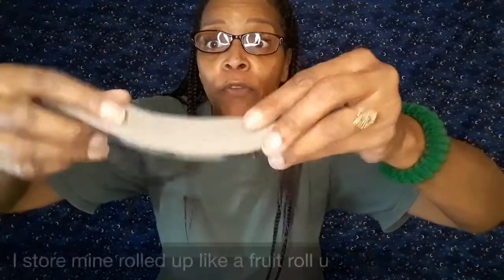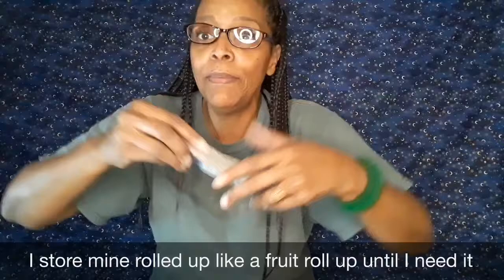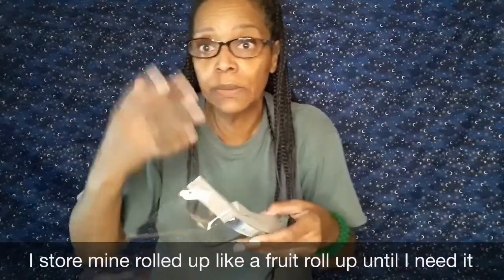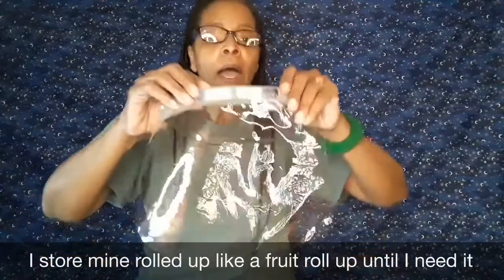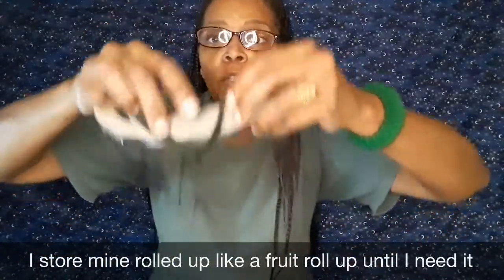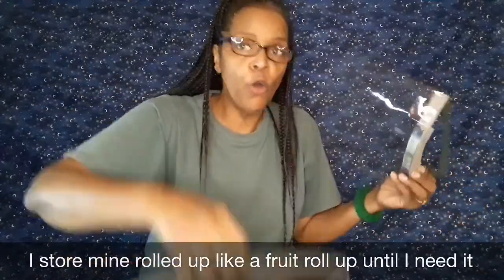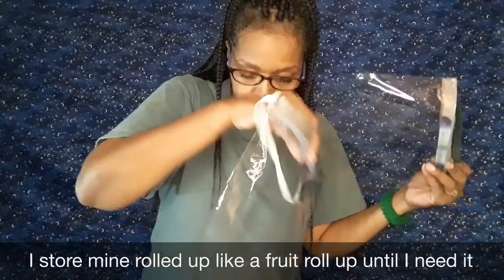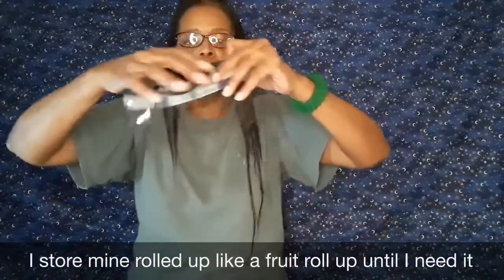And then if you really want to do it up like some of the ones that I've made, oh, and you can also put an extra piece of foam on there if you want, maybe your glasses stick out, or your cheeks, or your nose, and you want a little extra room. So you can put another piece of the foam right on here, and it'll stick adhesive wise, and it'll be ready to go.